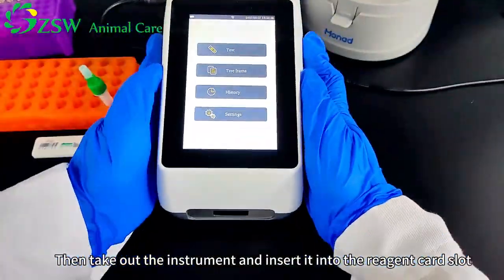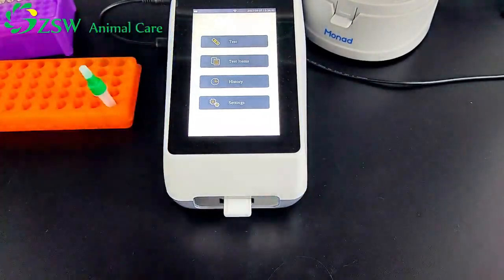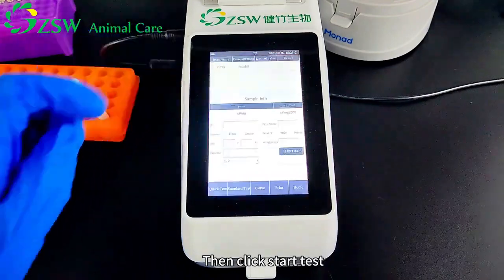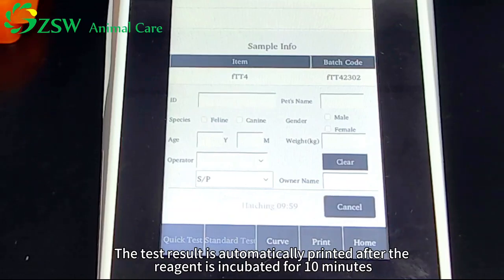Take out the instrument and insert it into the reagent card slot. Then click Start Test. Click Standard Test for automatic card reading detection. The test result is automatically printed after the reagent is incubated for 10 minutes.